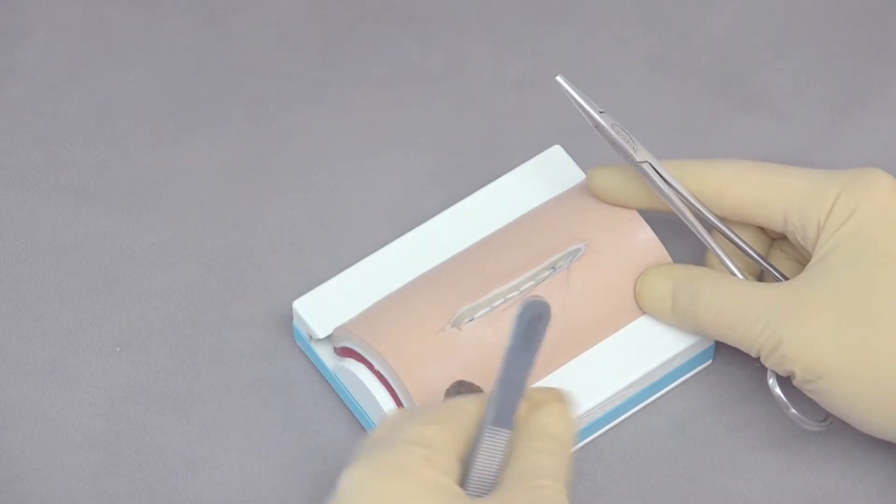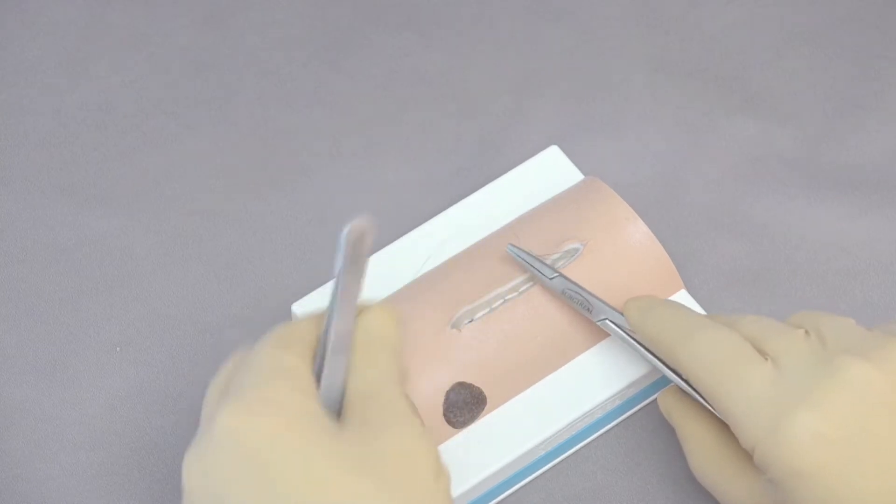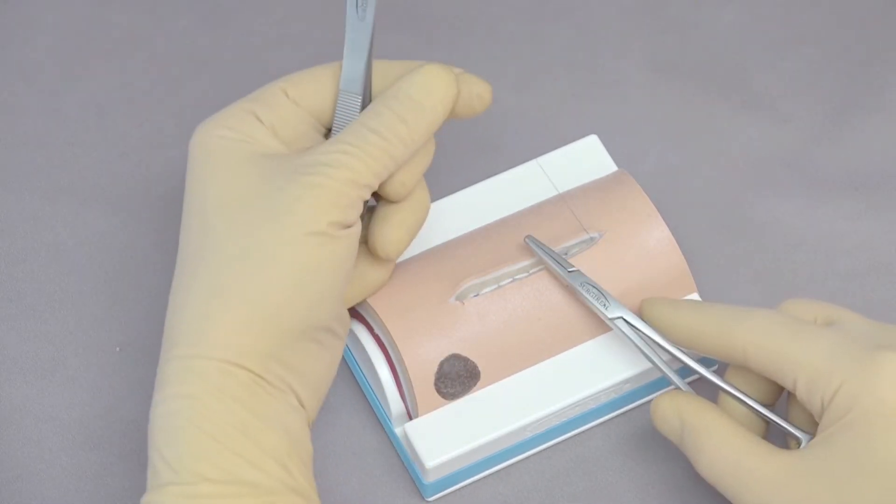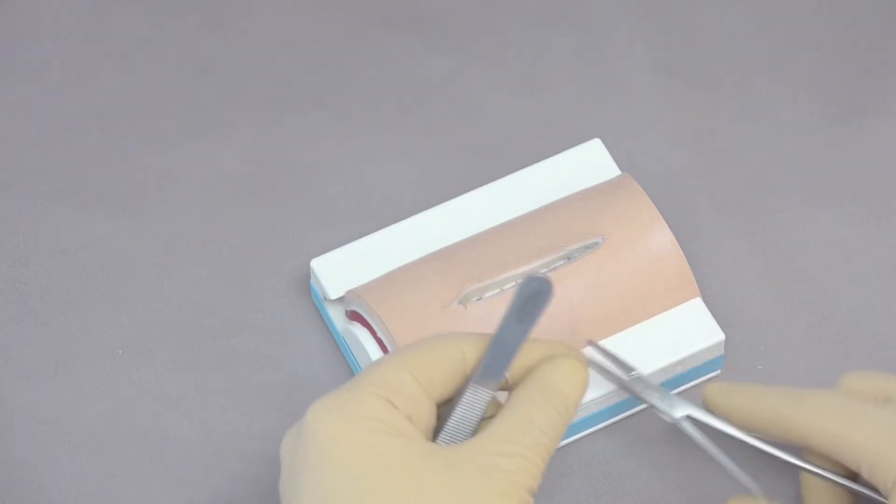When you're burying a knot, the whole concept of burying a knot is to start your needle and finish your needle where you want the suture to end up or the knot to end up. So in this case everything is deep.